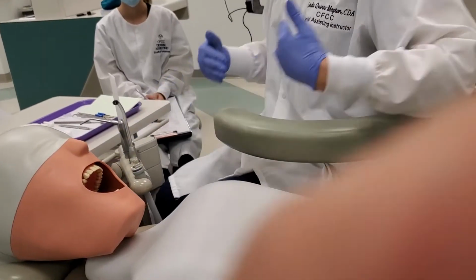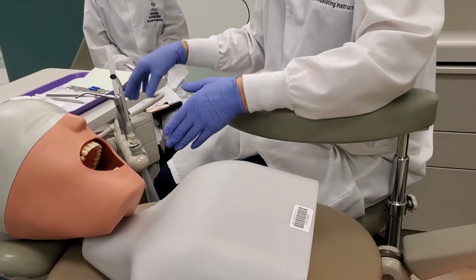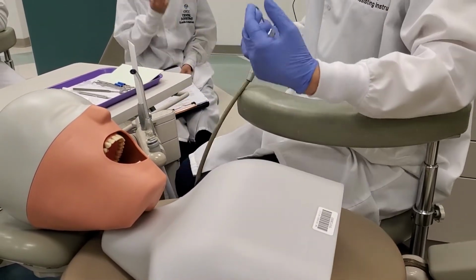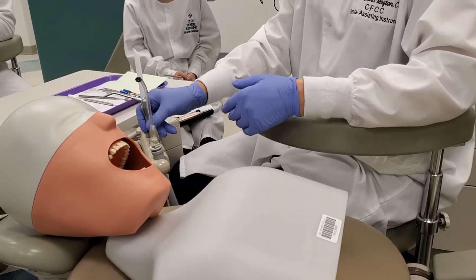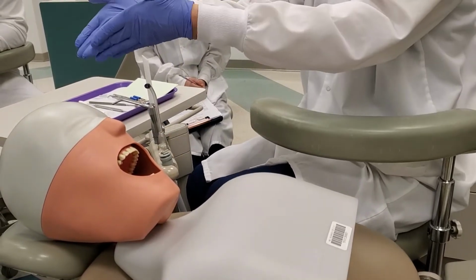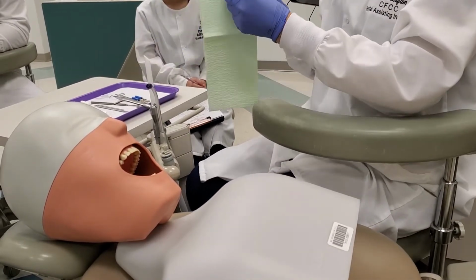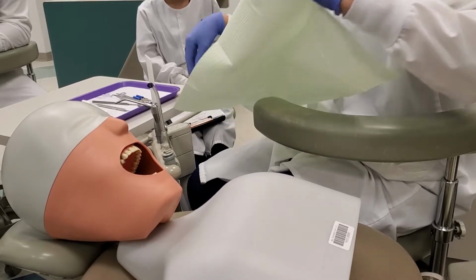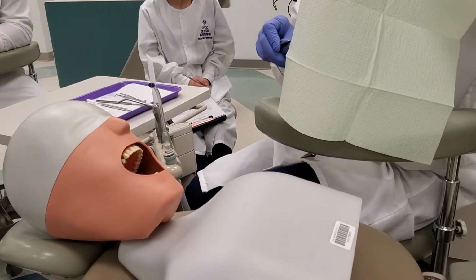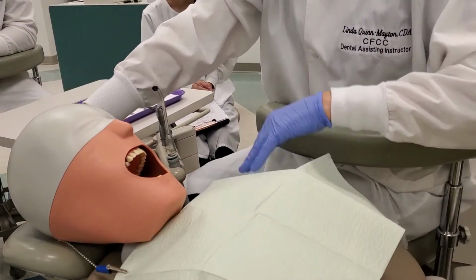This facing you. See how it's opening here? You always want that facing you, because inevitably you'll be picking these up, putting them down, and you'll get the cords tangled up. So if it's going to fall, it's going to fall on you, not that way, because that's a nightmare if that happens. You're out of the class, you have to deglove, do all that other noise, and then have to come back. So always have that facing you all the time.